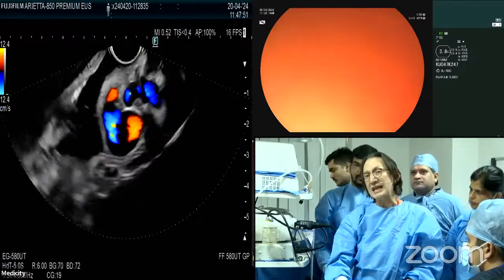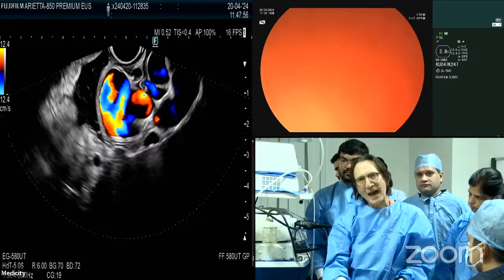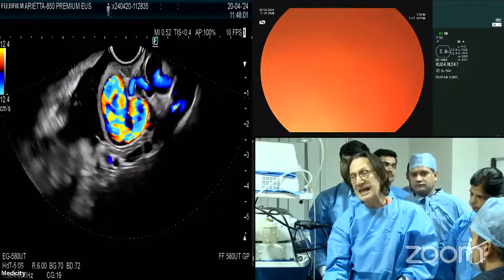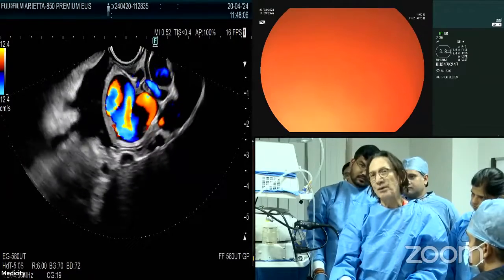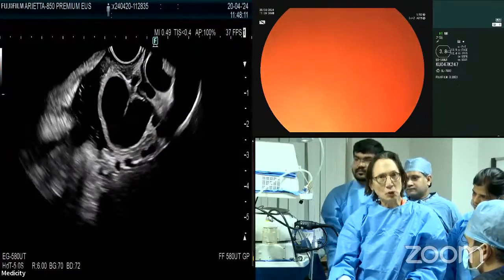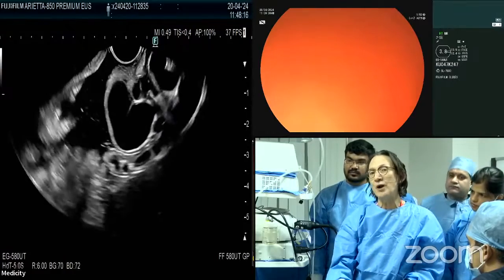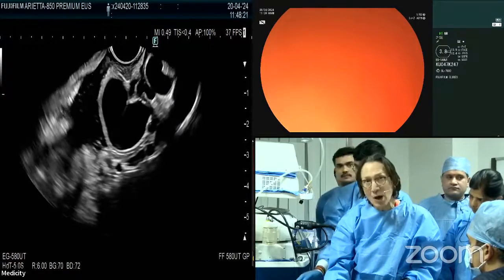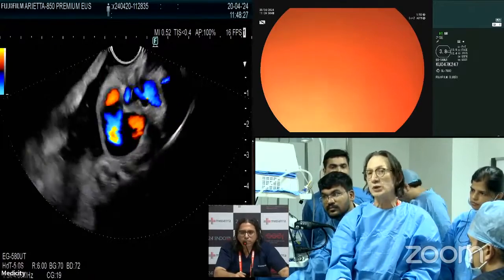Even though you could target this with a gastric approach from the cardia, I prefer to pull back into the esophagus and go transesophageal from the back side. I like to use the crus muscle as a backboard to prevent back bleeding — it stabilizes everything and ensures I'm not going to get torrential bleeding. If you go from the gastric mucosal side, the mucosa is thinned out; you puncture it under high pressure and it can suddenly start bleeding torrentially.